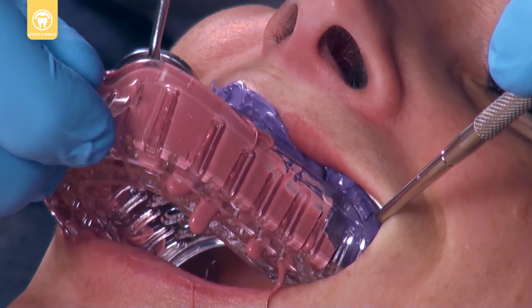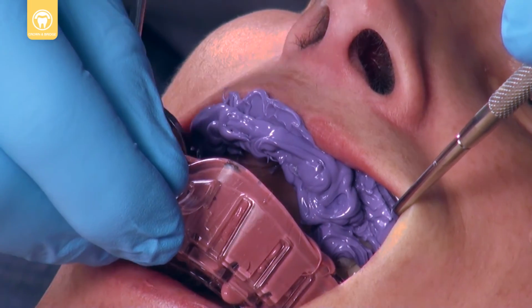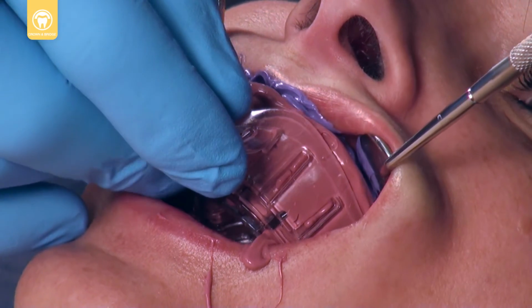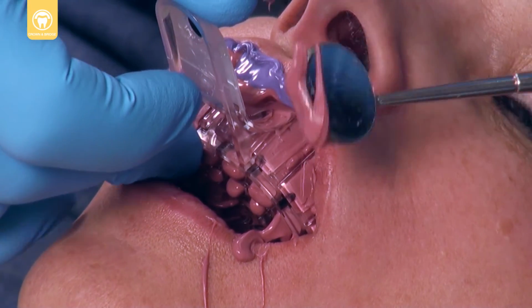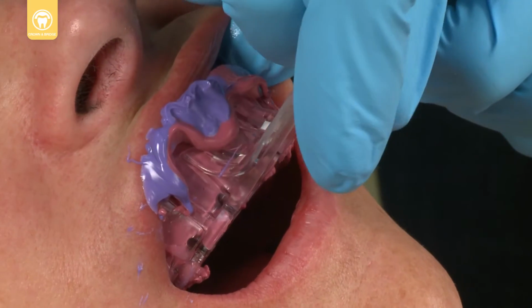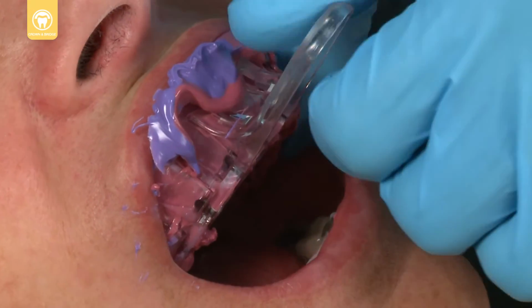Place the impression tray in the mouth. Make sure the tray is centered and gently push the tray onto the teeth. Take care to not force the tray. You do not want the patient to bite down to the impression tray, as that can distort the impression. You want to keep some impression material between the teeth and tray to get the optimal impression.